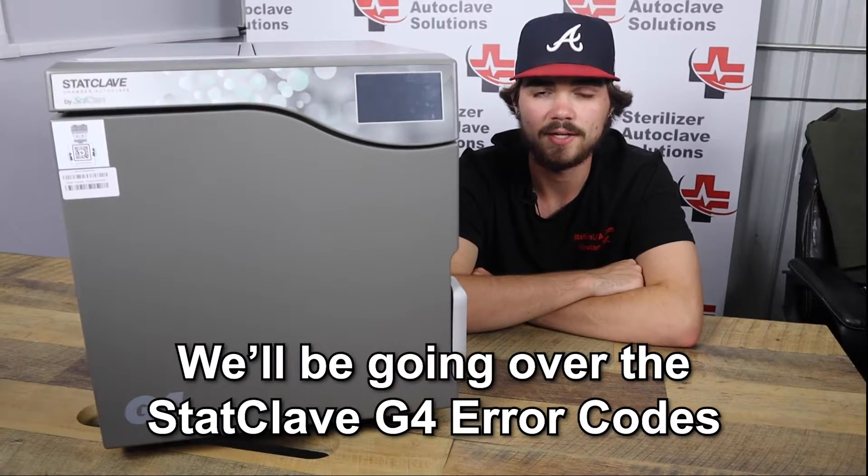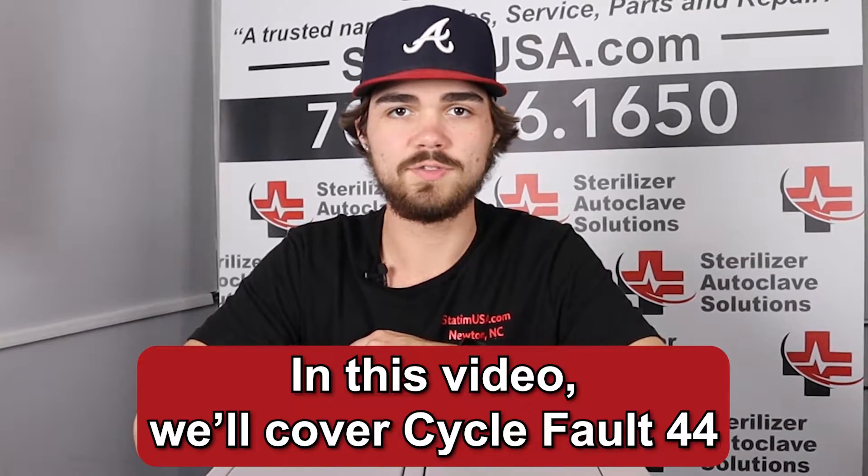Hi, this is Jacob with Sterilizer Autoclave Solutions, and today we're going to be going over the Staticlave G4 error codes. So we're discussing Cyclefault 44 on the Staticlave G4.